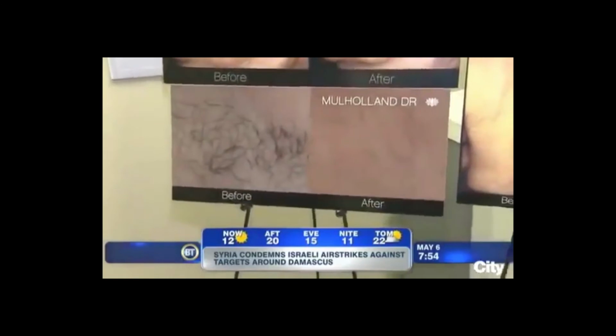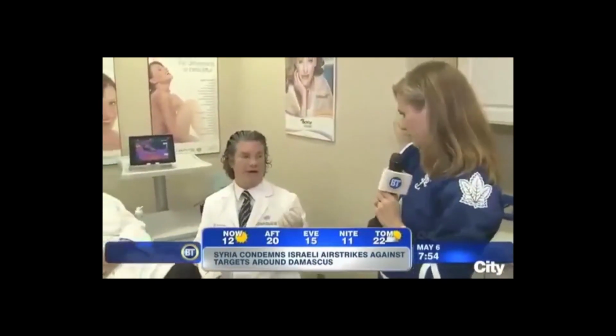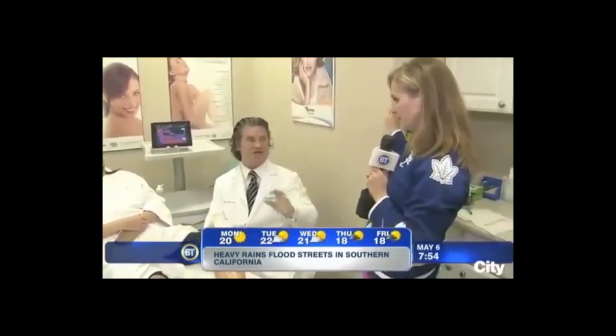I don't know if this is still true, when you have light hair, that's really hard to remove. Yeah, light hair, gray, blonde, and red hair, much more difficult because the laser targets the pigment. But can you do it? Not very effectively. Usually that's going to be waxing and electrolysis. But if you have white skin or dark skin and dark hair, these products are made for that.